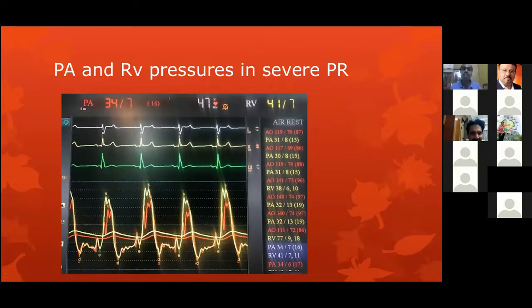Normally we don't take a simultaneous pressure trace in any right-sided chamber because many of the interventions do not warrant such an intensive simultaneous measurement of right ventricle and pulmonary artery. But pulmonary regurgitation interventions, that means percutaneous pulmonary valve implantation, can only be assessed in its efficacy by understanding how much ventricularization is there at the beginning.